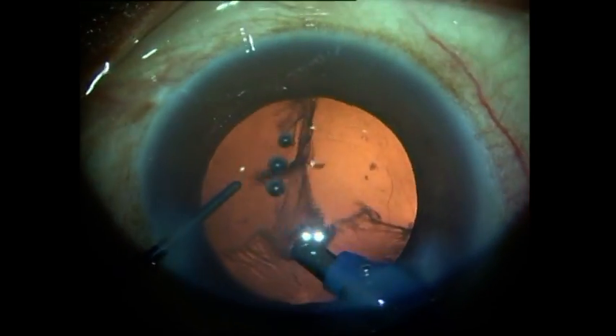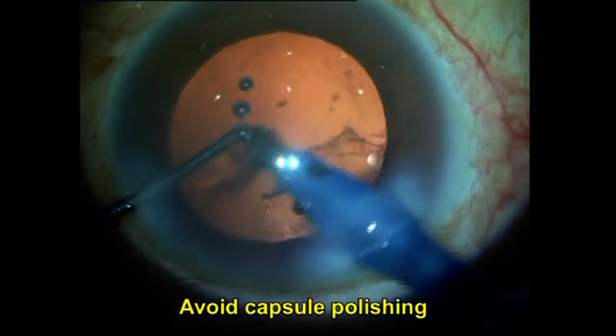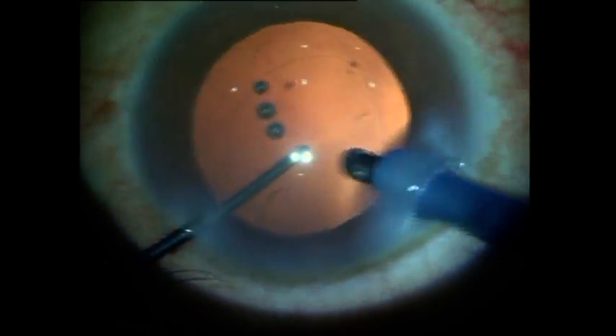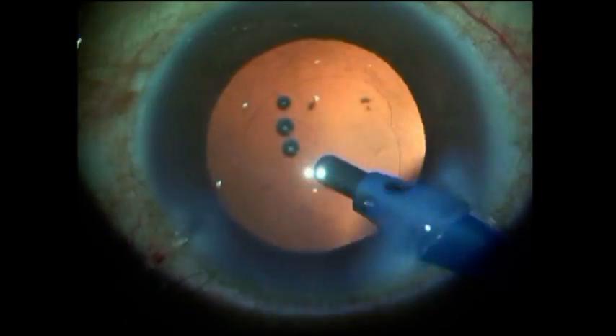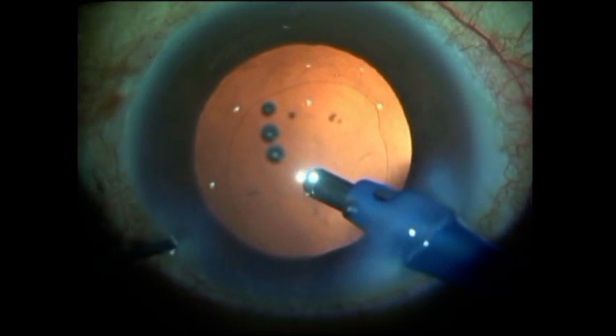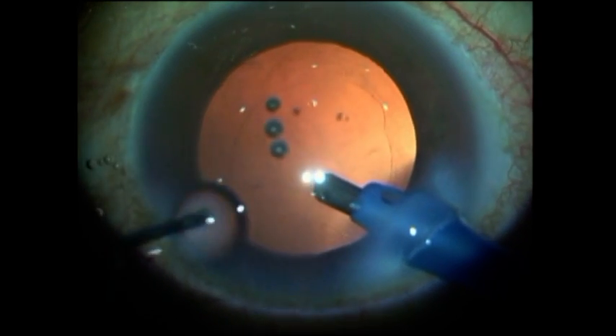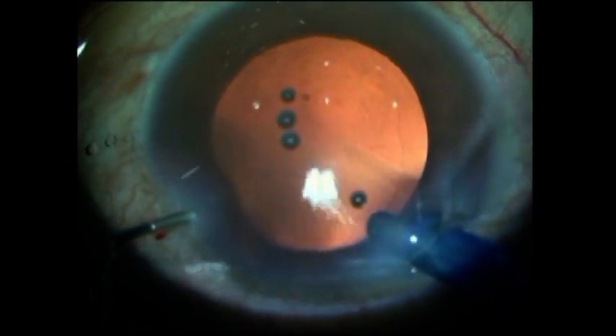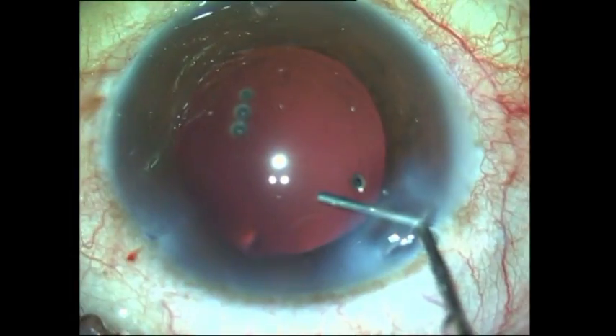Any plaque or cortical fibers that are left can be ignored and handled with a YAG capsulotomy at a later date. Again you can see me injecting viscoelastic before I come out with the IA probe — this is to avoid sudden chamber fluctuations, which by itself can cause the weakened posterior capsule to rupture and cause a posterior capsular rent.